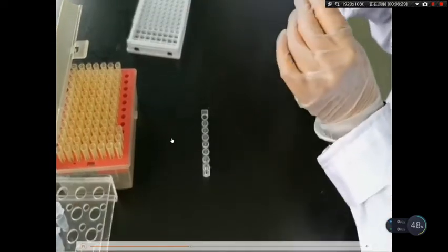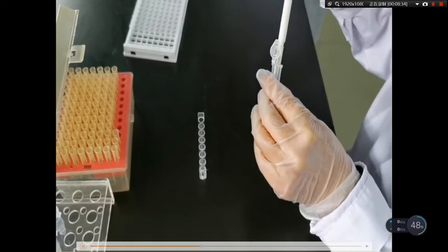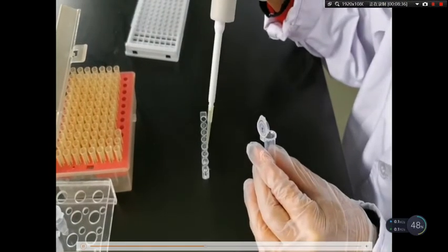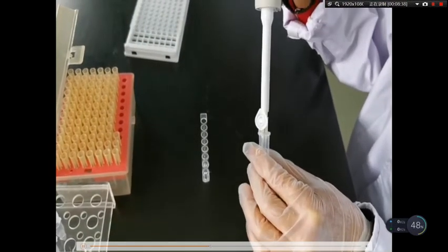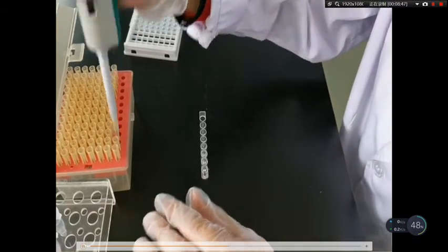And the next 2 vials with negative serum. Another 2 vials with wash buffer as blank.